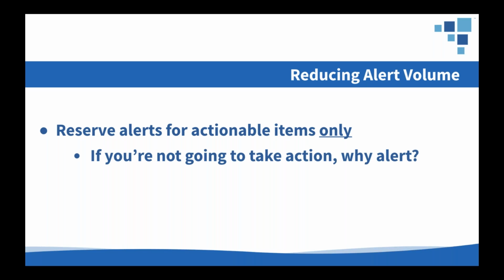you really shouldn't be alerting on it at all. For example, if you're getting alerts when the PACS drive reaches 90% utilization, but you're ignoring it because it's not urgent yet, two things are going to happen. Sooner or later, you're going to get a server failure because you forgot to circle back on that alert before the drive filled up. And second, you're conditioning yourself and your teams to ignore alerts, and someone someday will inevitably ignore the wrong one, and you're going to have a major problem on your hands.